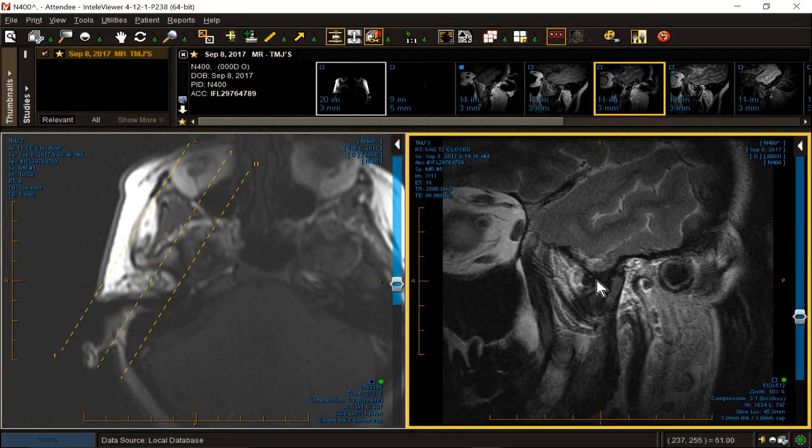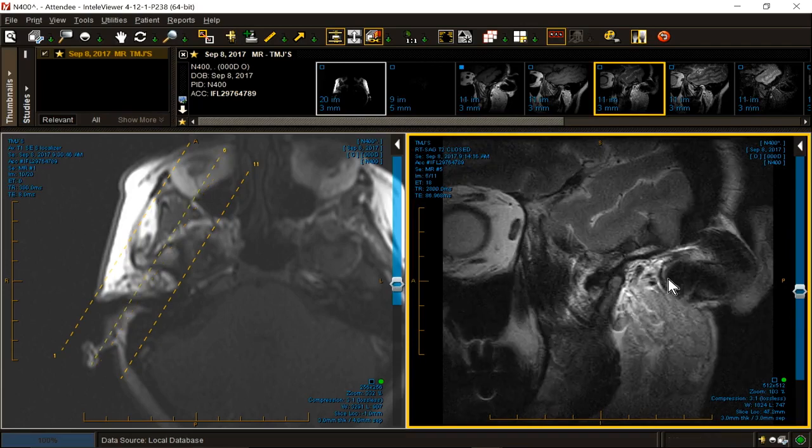So the meniscus and its attachments will divide the joint into an upper compartment and a lower compartment. So when you're looking for fluid, you can see it up top, you can see it down low. We don't do arthrograms anymore. I haven't done one in 10 years, except in attorneys that I want to torture.